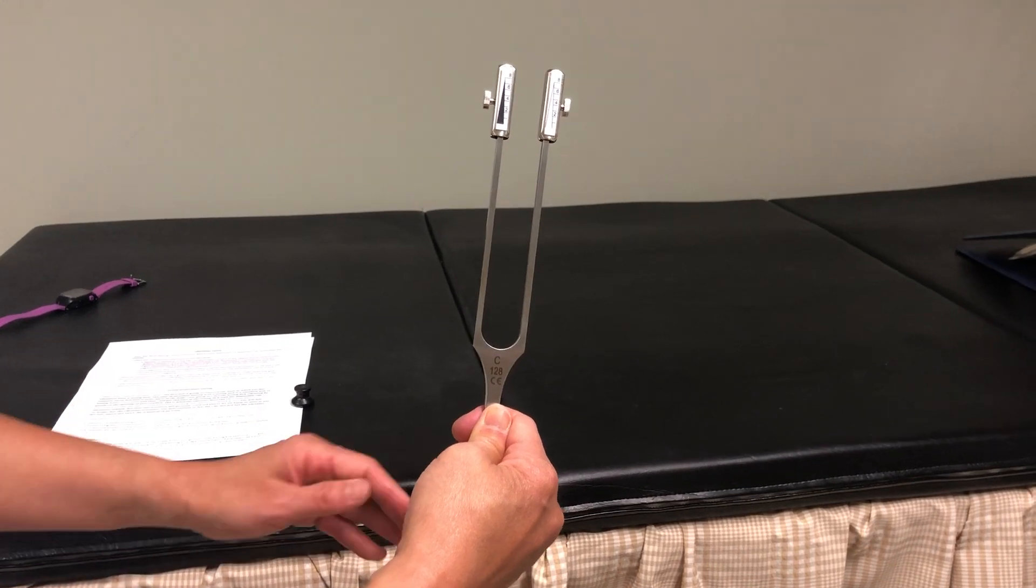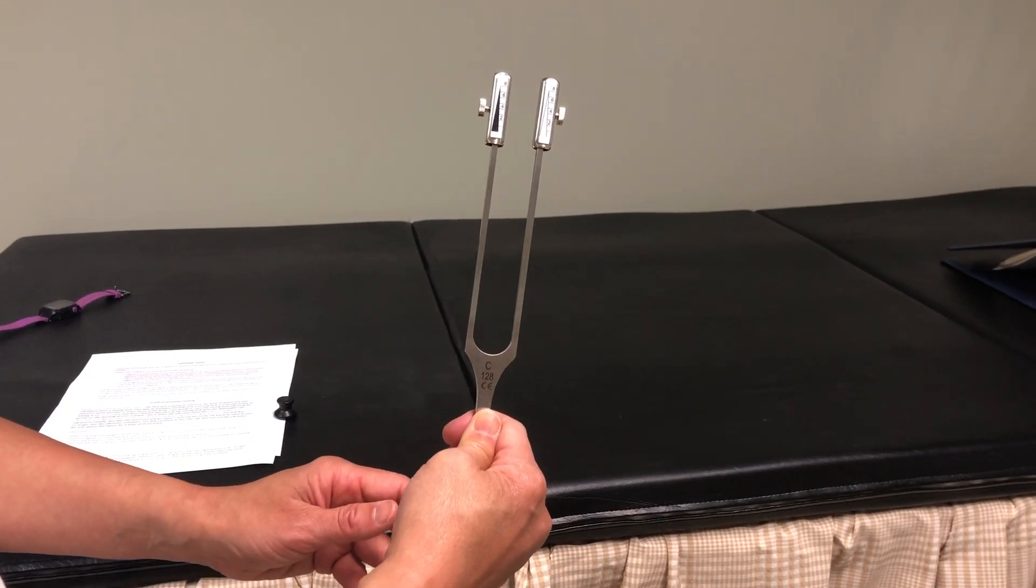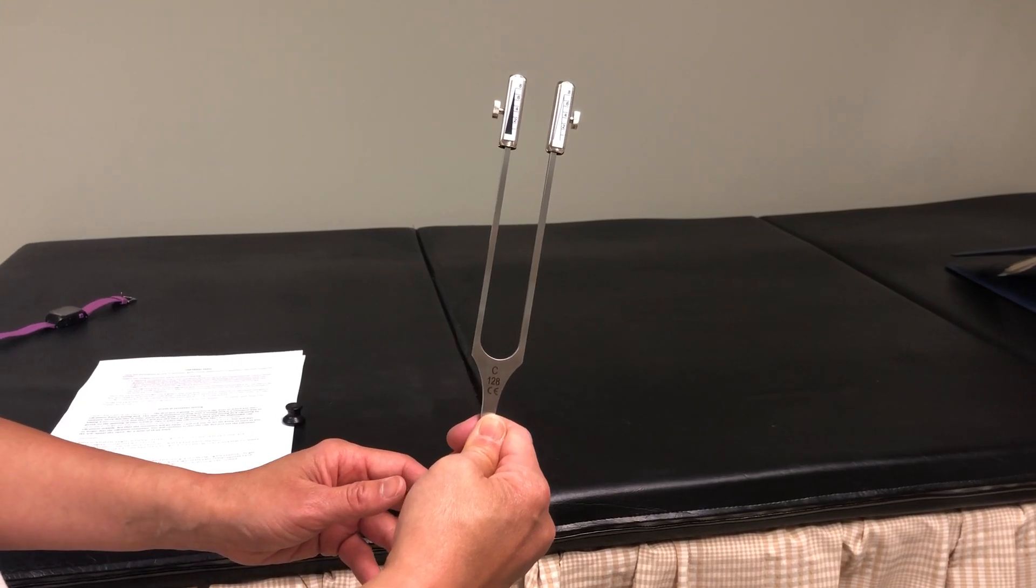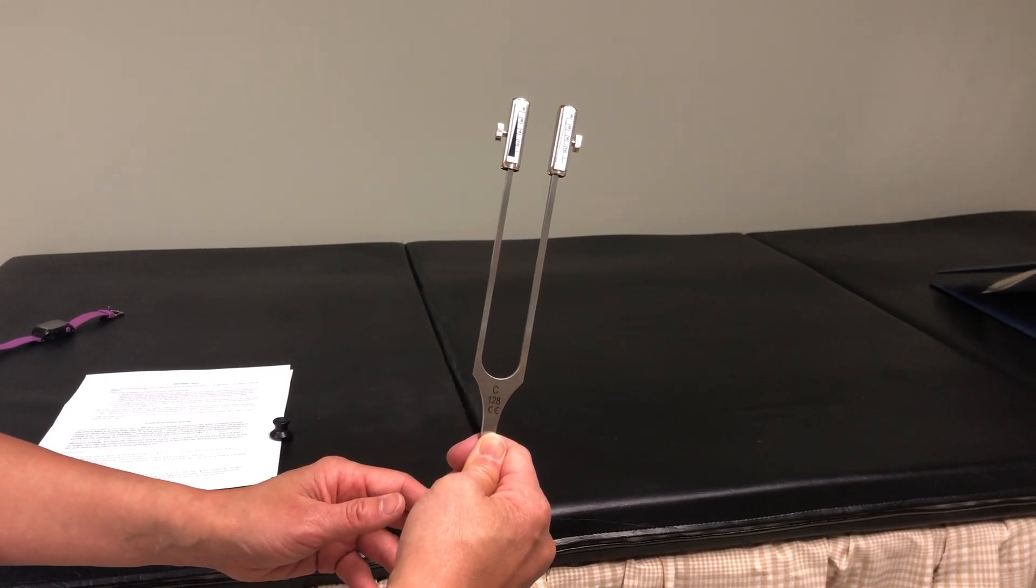The first test is going to measure the level at which you feel vibrations from a tuning fork. This type of sensation testing is a standard way to measure nerve function in parts of the body.